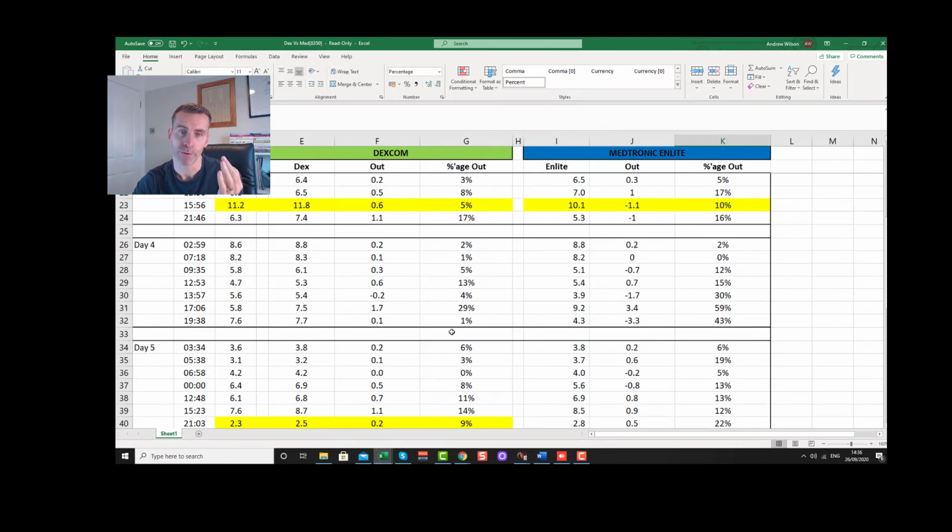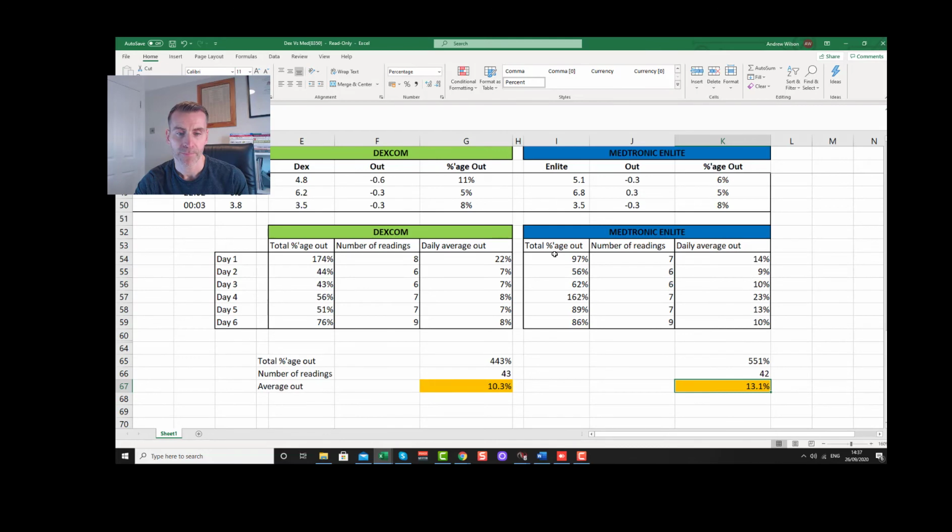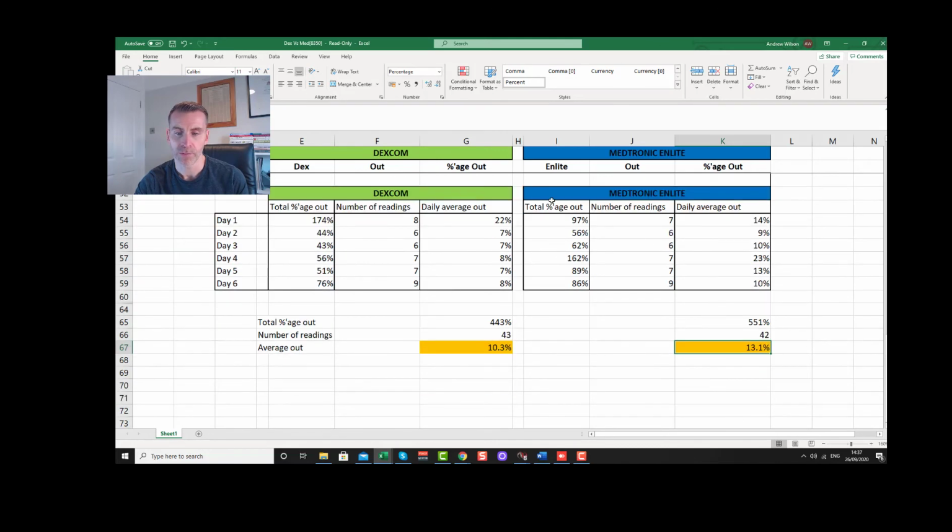The only issue arises, I would say, for me, who has more lows than highs, the only issue arises if it's 10% out and it's the difference between 5 and 5.5 or 4 and 4.5. It might be the difference between me taking some glucose. Overall, I'm pretty happy with those readings. So that is the final overview of that 1 week, and I realise it's just 1 week and it has its limitations, but that's where we sit.